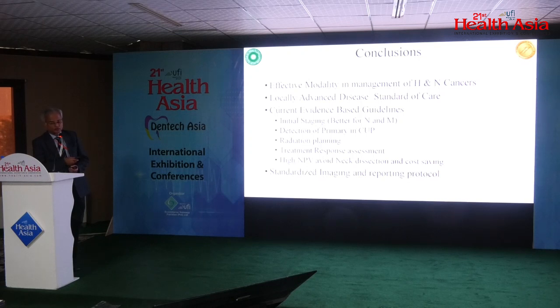it is considered as a modality of choice for treatment response assessment, early treatment response assessment, especially 3 months after the completion of the chemoradiation therapy. And finally, the high negative predictive value of FDG, negative FDG PET-CT essentially rules out the possibility of the neck dissection and results in cost saving.